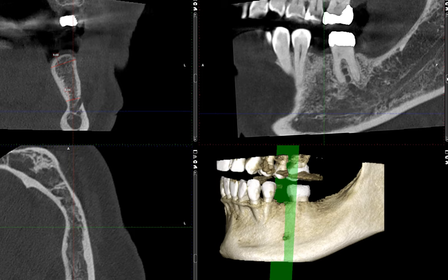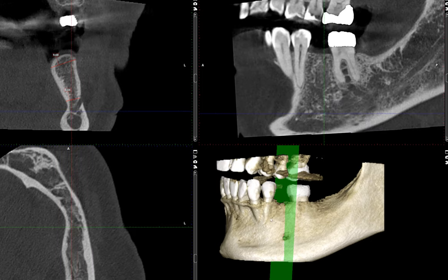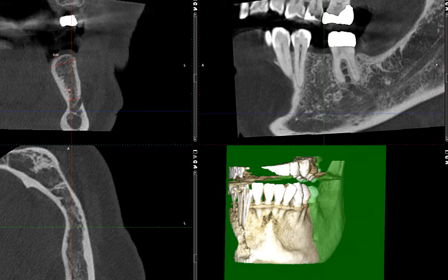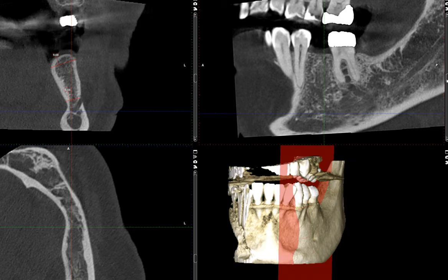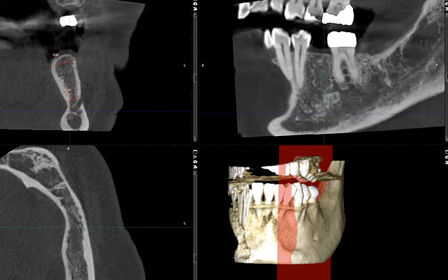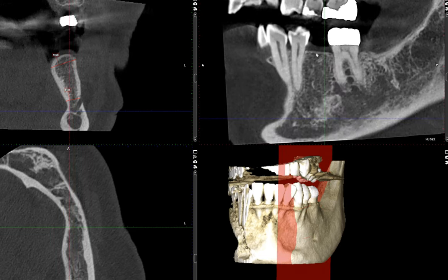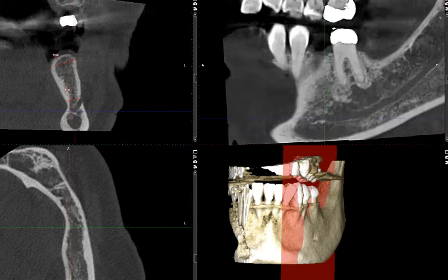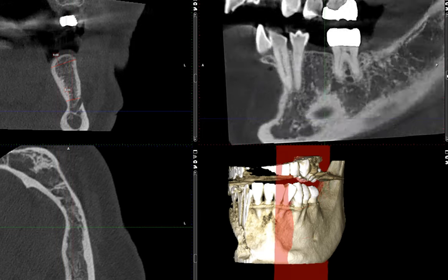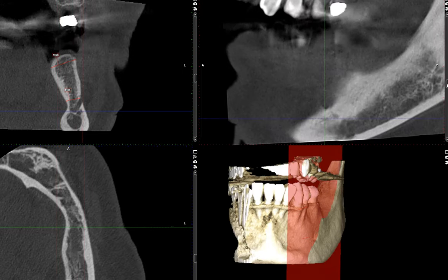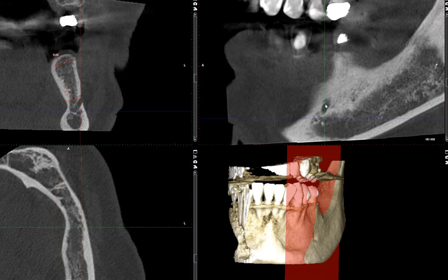Now let's look at this in the sagittal view. I'll go ahead and turn on the red sagittal plane and look at this site. The overall bone quality looks very good and has healed normally. You can still vaguely make out the original lamina dura from before the extraction. And there's that mental foramen. Let's look at this site in the cross-sectional view.